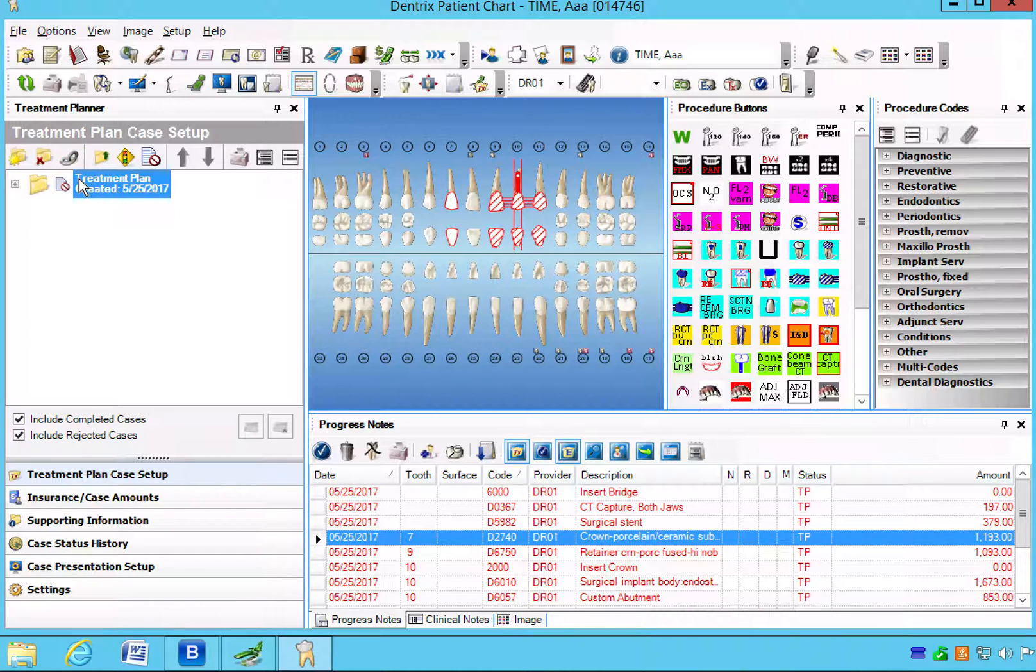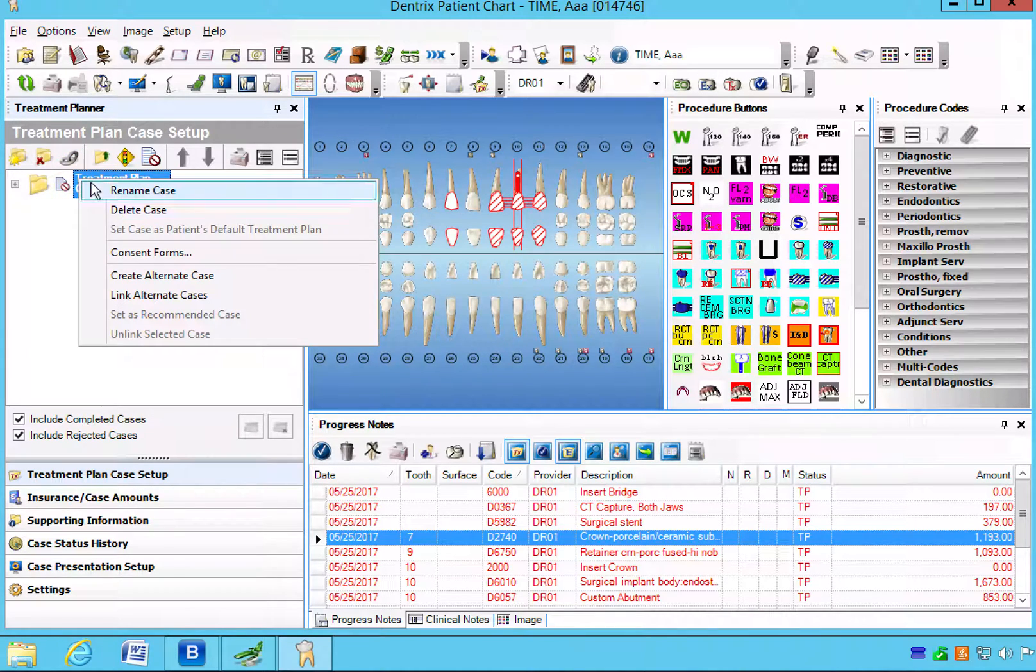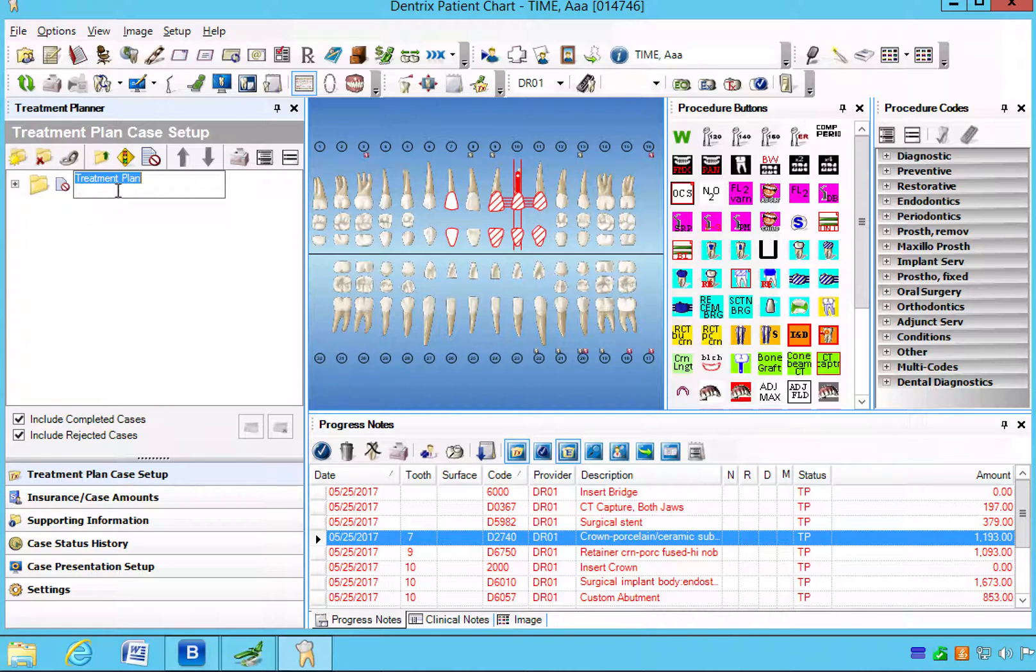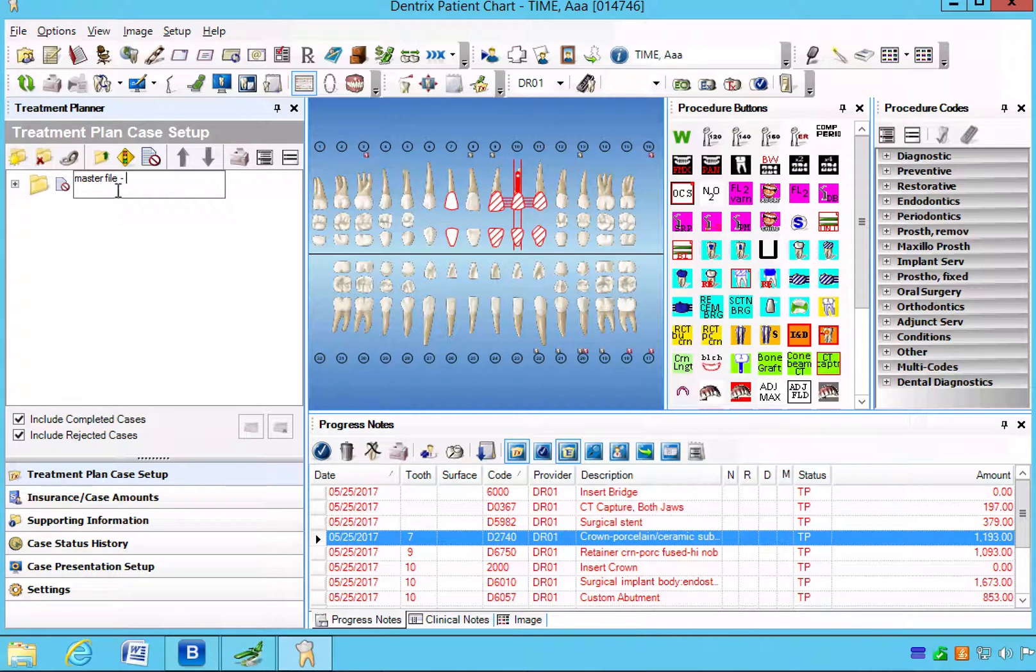So first thing we're going to do is rename the case, and we're going to rename it the master file, and I'm going to put in here do not delete.